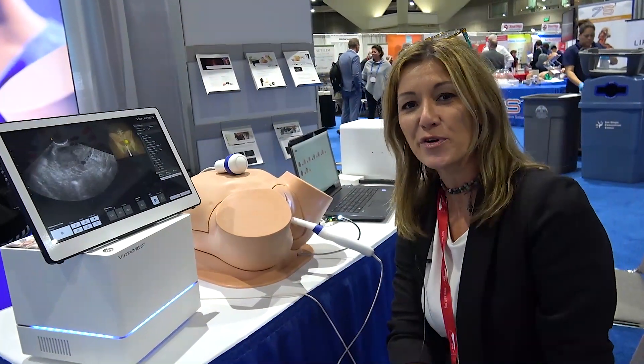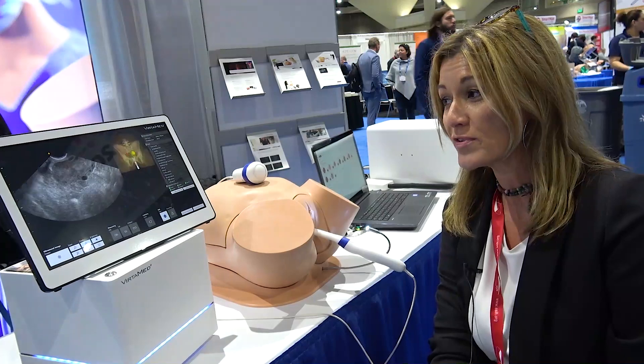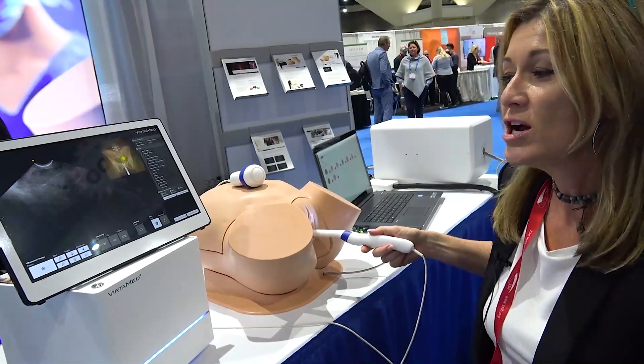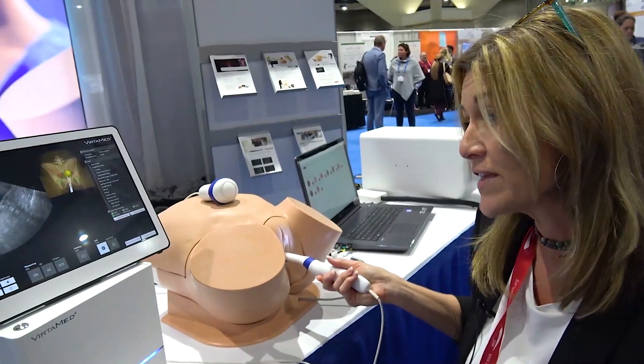Hi, I'm Kimberly Mazzilli with VirtaMed. VirtaMed is a Swiss-based company that specializes in surgical simulators, and what I have in front of me here is our new transvaginal obstetric ultrasound simulator.